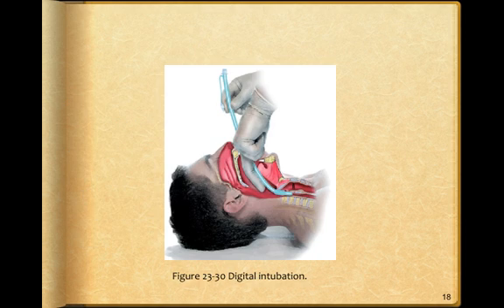This is a digital intubation. The only thing that I would suggest here is please be careful if the patient has had a seizure, because there's teeth right there. Our fingers do not grow back quickly. They don't grow back at all. So if the patient has a seizure or clamps down, you could cause injury to your own digits. So just be aware of that before choosing digital intubation.